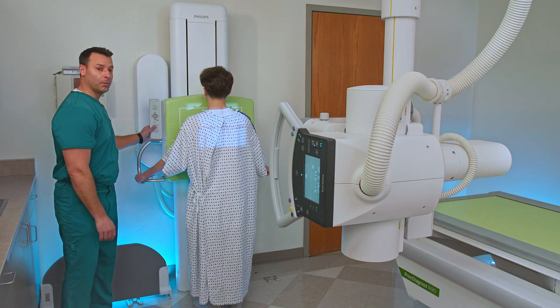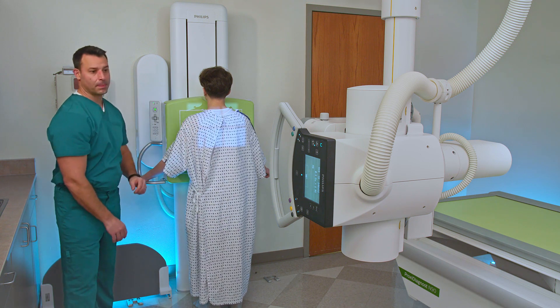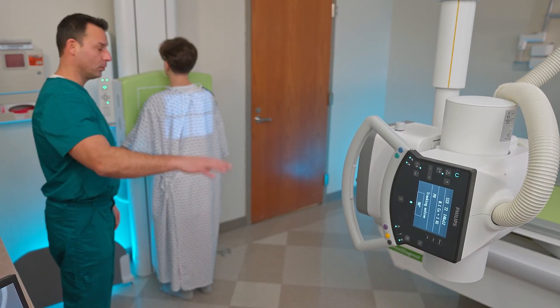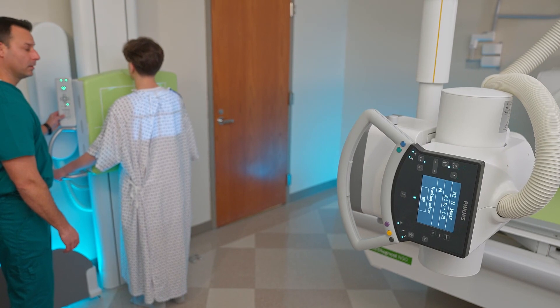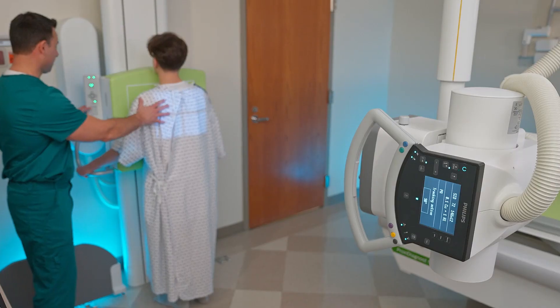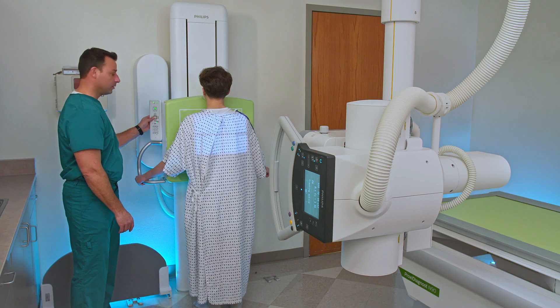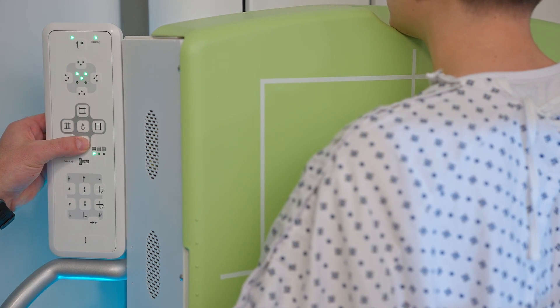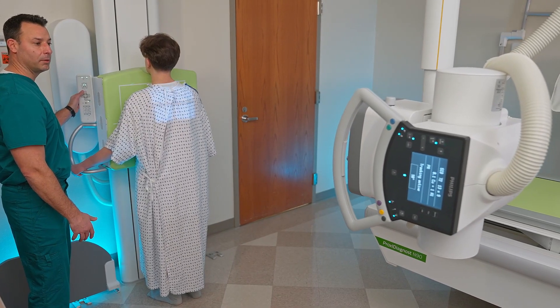We can come over to our wall bucky here and do our movements to set up patient positioning. We have the ability to turn on tracking on the tube, so the tube tracks with the wall bucky. When I move my wall bucky, the tube will track with it, so I can position my patient from here and the collimator will be where it needs to be on the patient. I also have the ability to collimate from the side of the wall bucky — in or out, side to side, or up and down with top and bottom collimation. With tracking on, the tube will track to wherever the collimation is open to.